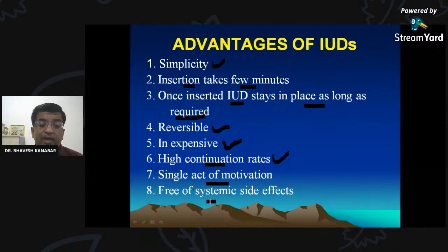Free of systemic side effects. In the oral contraceptive pill, as you know, there are so many systemic side effects, including effect on blood pressure, effect on the heart, effect on the venous system. So in this IUD, there are no systemic side effects. So it is free of systemic side effects.